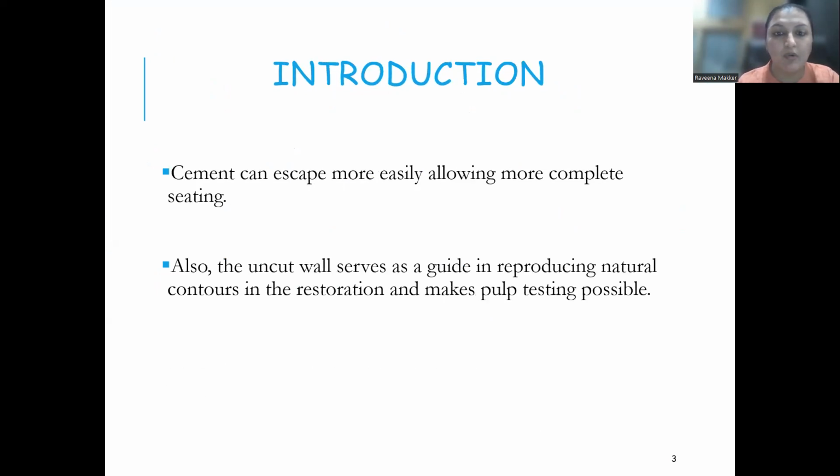Cement can escape more easily, allowing more complete seating. Also, the uncut wall serves as a guide in reproducing natural contours in the restoration and makes pulp testing possible.